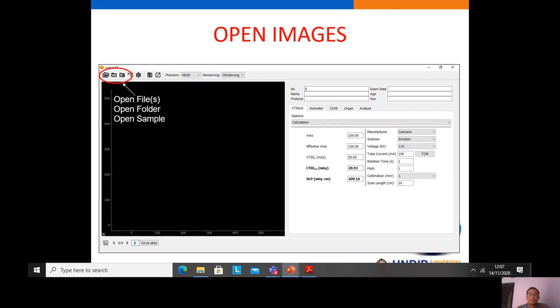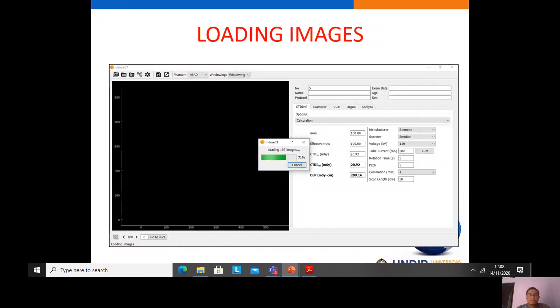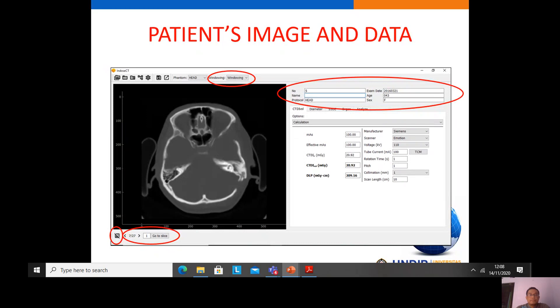If you want to calculate the diameter of the patient, we should open the patient images. There are three options to open images: using open files, open folder, or open sample. The open sample is for using the software for education purposes. If we choose open files, we click open files and then click open. This shows the loading of the images — we wait a moment for the images to appear.